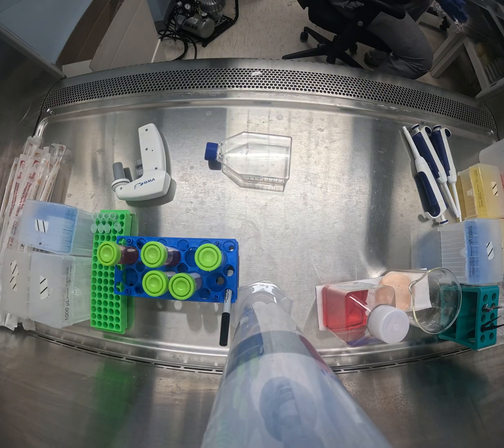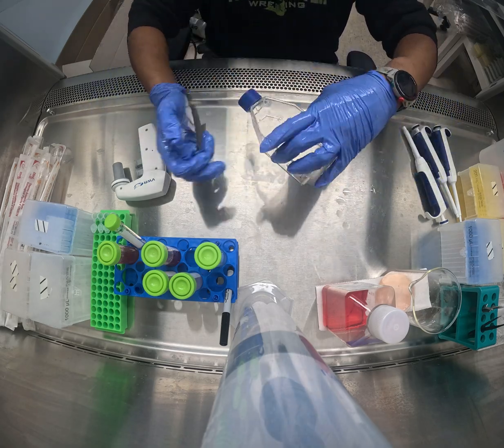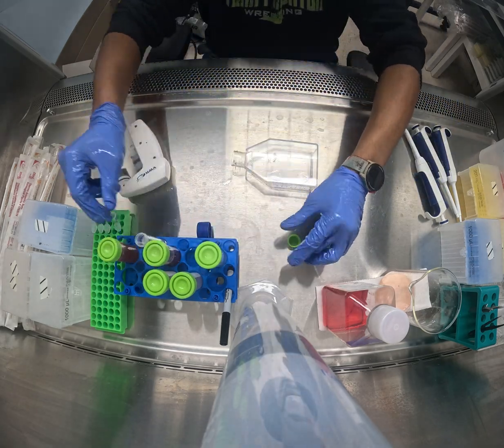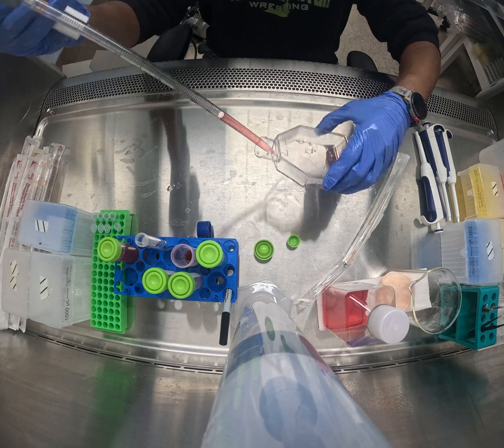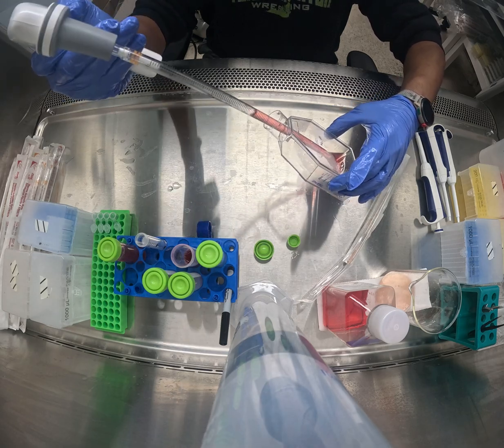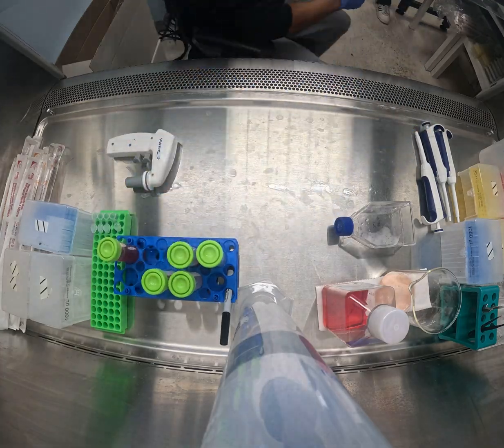After incubation, grab a 15 milliliter vial to transfer your cells into. Open the flask and add 3 milliliters of medium if using a small flask, or 9 milliliters of medium if using a large flask, and wash at least 3 times to collect all cells from the flask, tapping the sides to help detachment if needed.